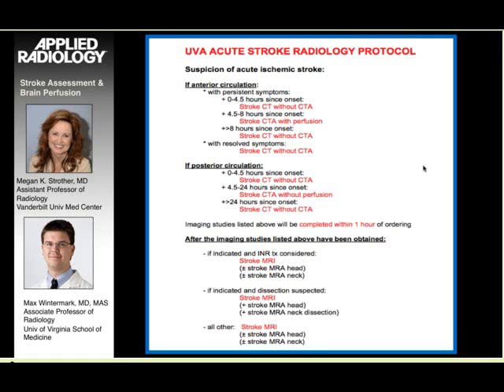And the idea behind these strategies, again, is that at our institution, CT is easier to obtain in the acute stage to make a very initial treatment decision or a very initial management decision, and we keep MRI for the second stage to better characterize the type of stroke that the patient had or to try to understand what was the mechanism of the stroke so that our colleagues, the neurologists, can subsequently decide the optimal therapy to prevent the stroke from recurring.